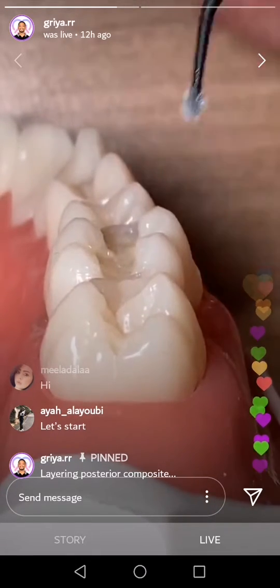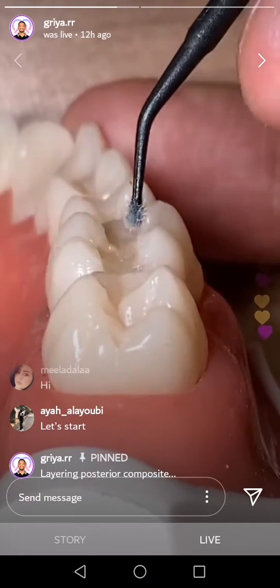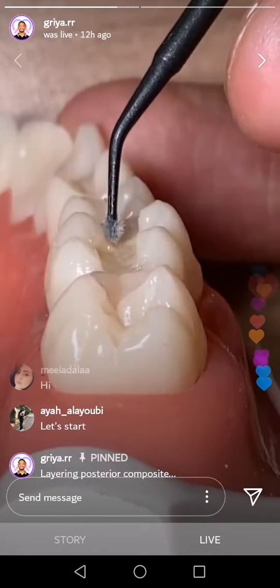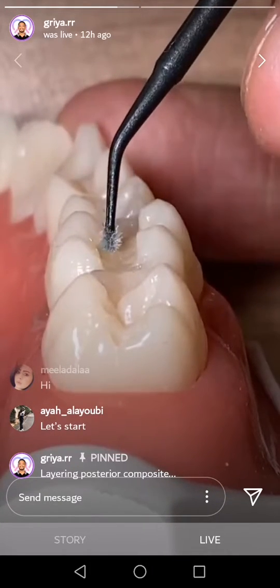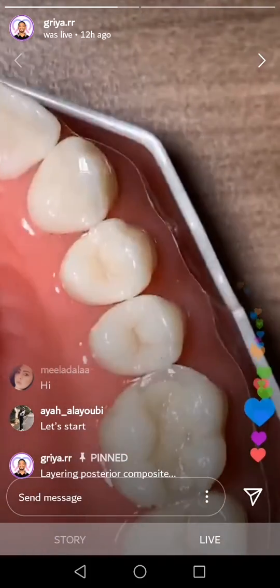Jadi dia udah langsung. Jadi kalau satu bola ini round, that all microbrush already put inside in here, ya, dia udah 2 mili nih, 2 mili, 2 mili, 2 mili. Oke ya, ngerti ya? Mudah-mudahan ngerti lah.